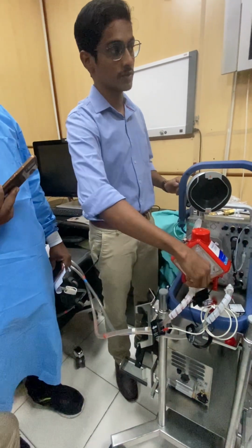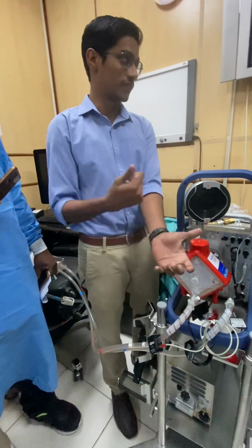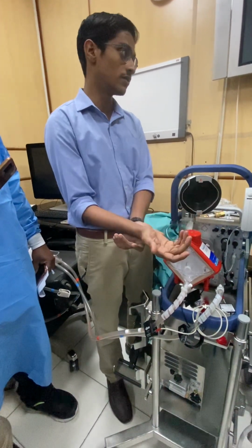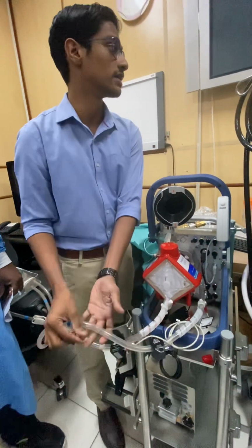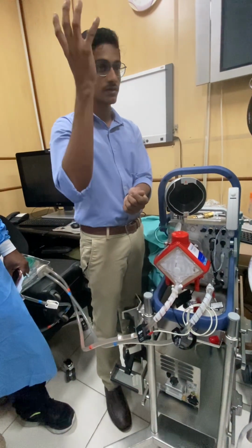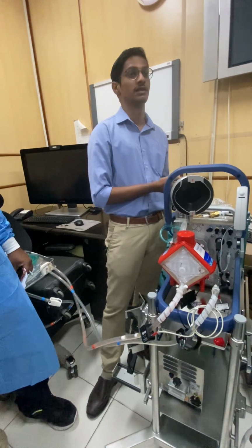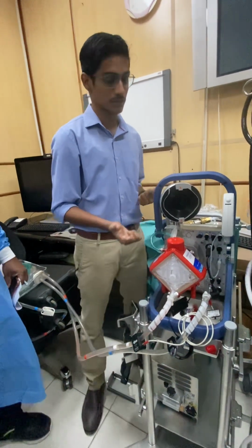अगर आप ये खोलोगे तो भी बाहर ही बाहर आएगा. की तरफ में पुश होगा. पर अगर आप इससे कुछ फ्लश कर रहे हो, ऐसे कुछ कर रहे हो और आपने एयर अंदर, you are forcing it in, then it will go. बट वीनस साइड में ऐसे नहीं है. वीनस साइड में इसीलिए हमने कहीं पे भी कोई पोर्ट्स नहीं दिया हुआ है. और आपने कहीं पे भी खोल दिया, छोटा सा भी कट आ गया, it will suck it in, because 3 liters, 4 liters, minus 30, minus 40 mmHg, you are sucking the blood from the patient.